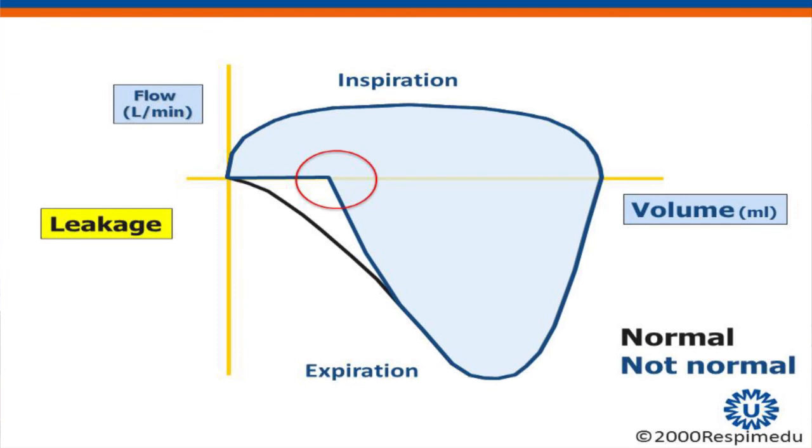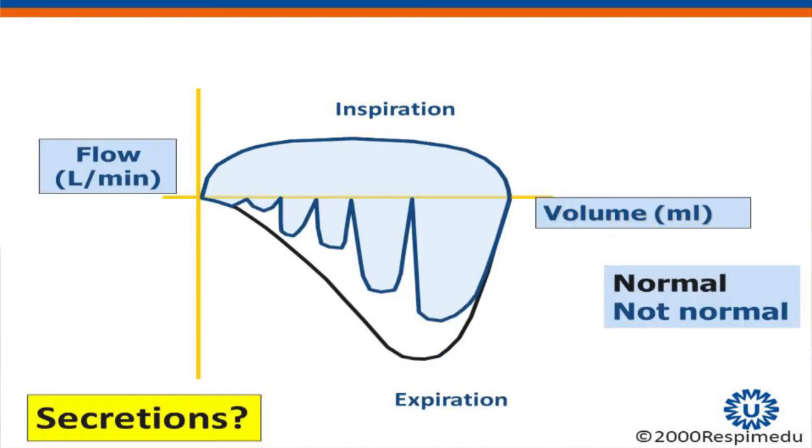And then the one we see most often, I think, is the last one. It's this one. You were waiting for it. Perhaps this patient needs suctioning. Yeah?